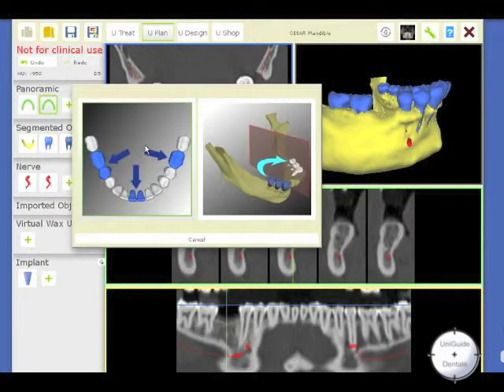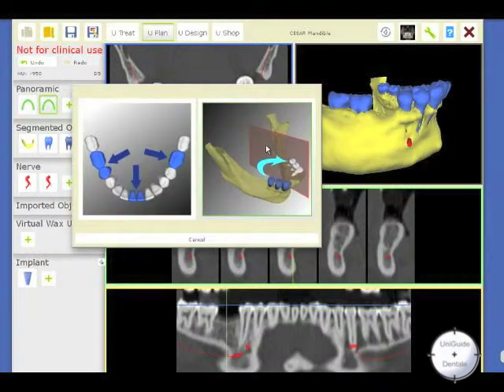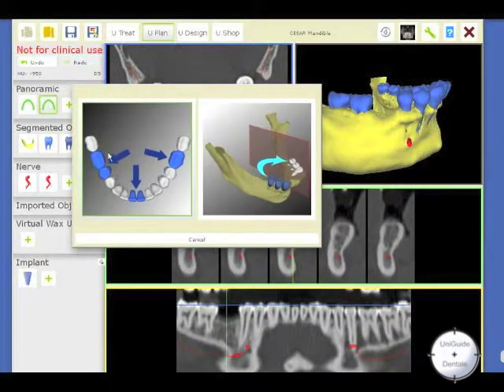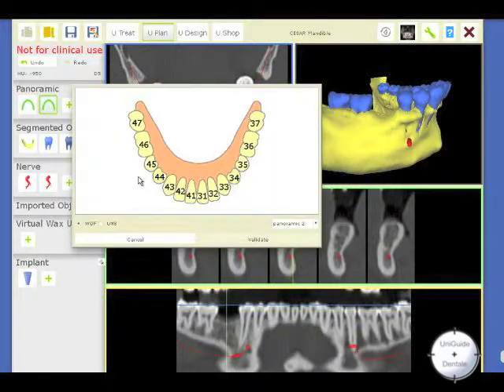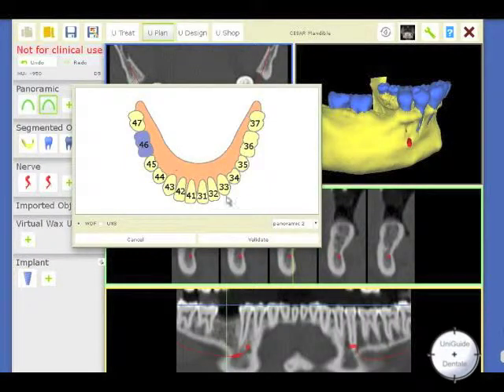You have two options. We are going to start with the first option. The first option is to use a library of teeth. You have to put the name of the tooth you want to replace.